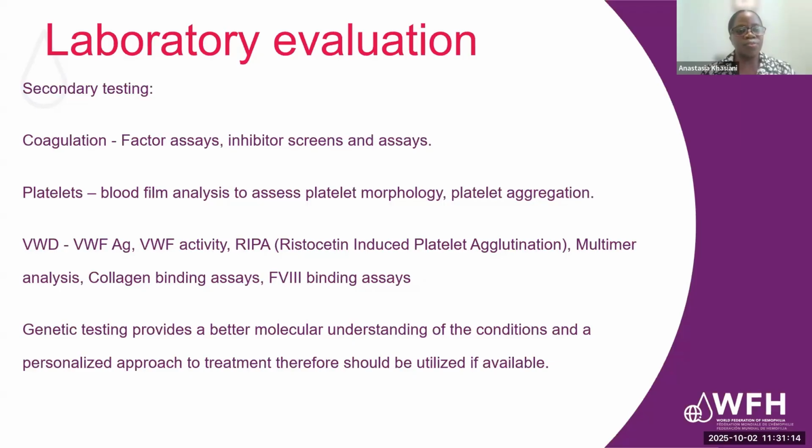And if the antibody present could be an antibody against phospholipids, then DRVVT screen and DRVVT confirm can be done and the ratio confirmed. And then once you have your report, that should be repeated after 8 to 12 weeks, just to ensure that this was not a transient type of antibody.